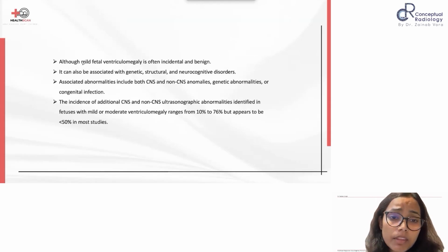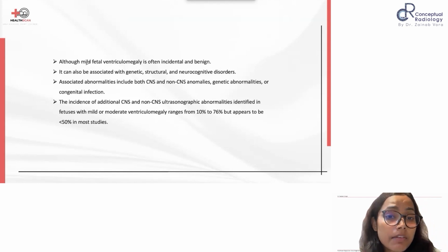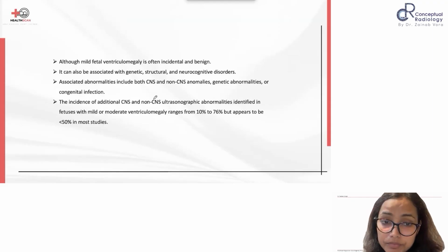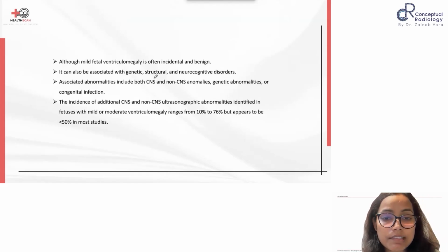And very often we encounter mild ventriculomegaly in our scan. This is often an incidental and benign finding, but any fetal ventriculomegaly warrants detailed evaluation, because it is often associated with genetic, structural, and neurocognitive disorders. And for that, apart from the detailed ultrasonographic evaluation, we should advise invasive testing, which is the amniocentesis.